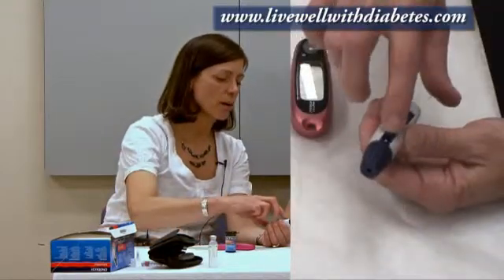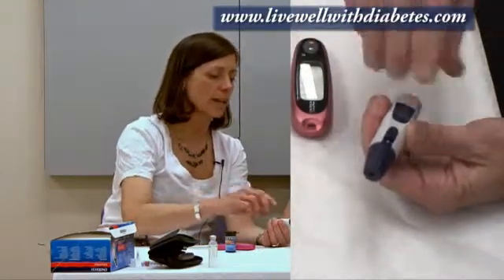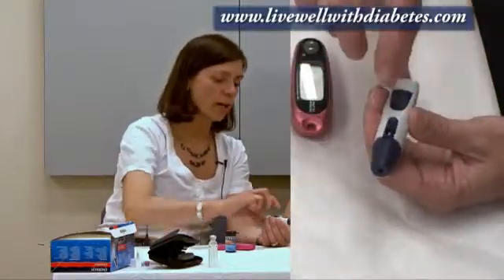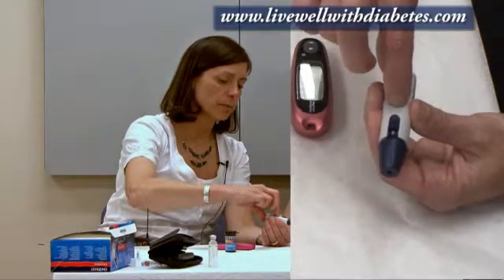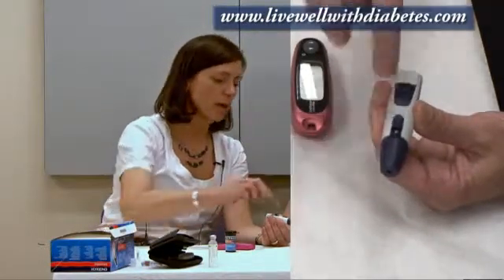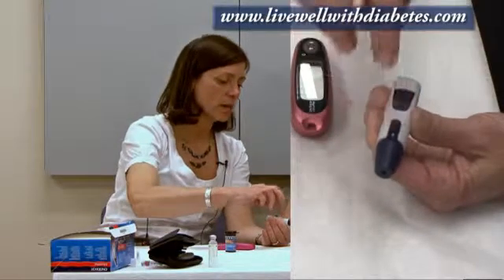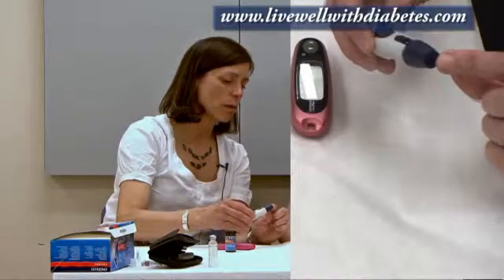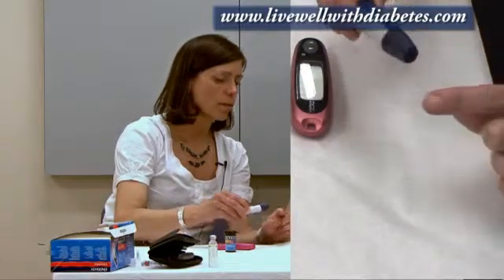I usually start it off on a lower number, and then if needed, I might make it go to a higher number. To set the spring, I hold this blue area and pull it back with my finger — that sets the spring. If I push this button, that will make the needle poke. On this end there's a hole, and that's where the needle's going to come out, so I have to put my finger there.